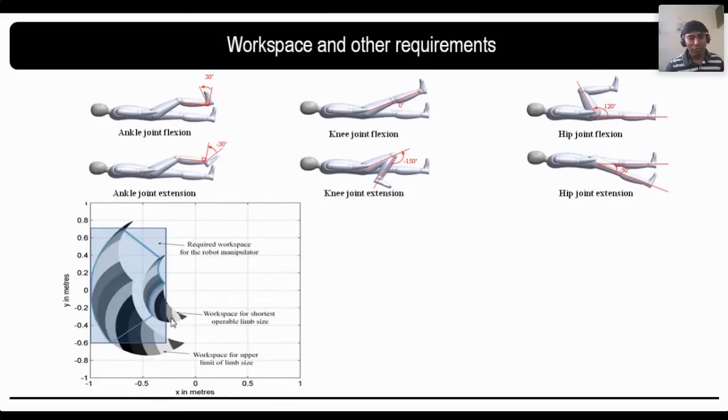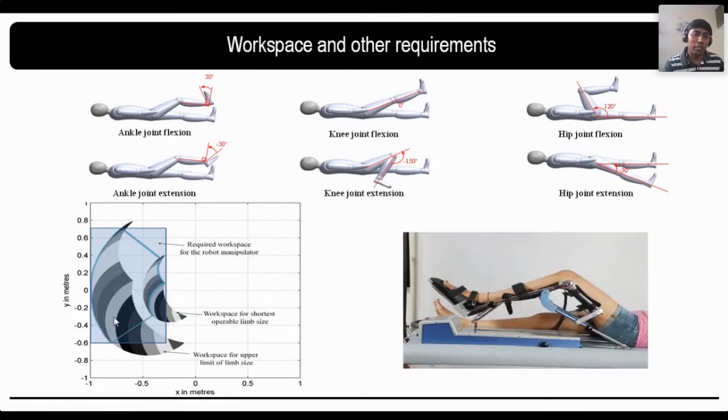So now the system development is done. On top of that, when you talk about physiotherapy, there is one particular treatment we call continuous passive motion. We simply call it CPM. The CPM would have only one actuator. It doesn't make several aspects. It would be attached to the leg. The leg would be completely stretched and folded in a continuous manner. When you energize, the system will go to and fro. Based on that, these two joints would be completely folded and stretched.